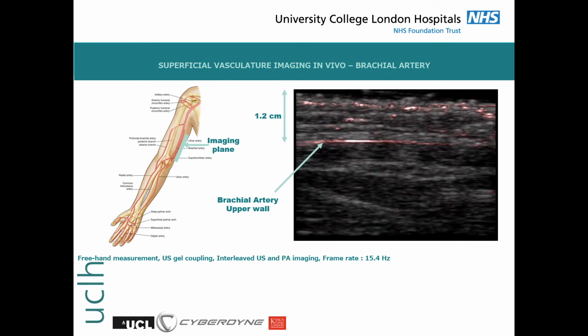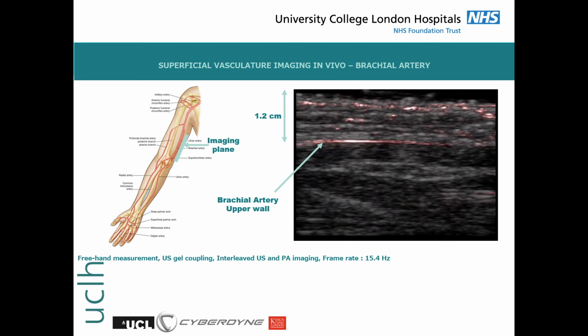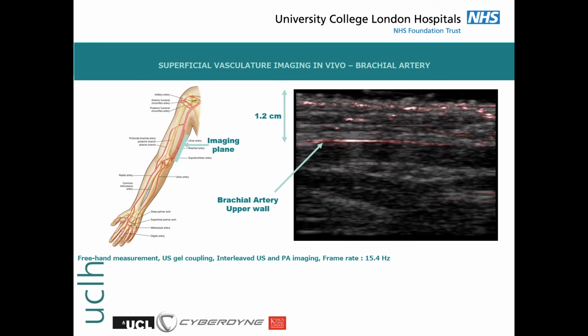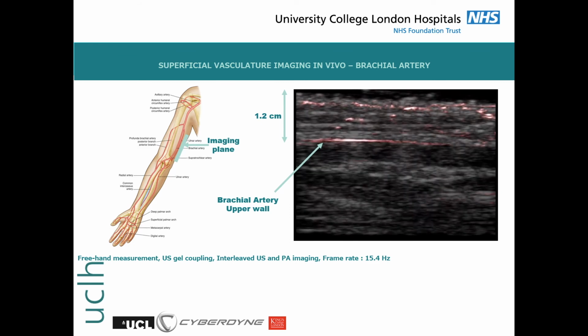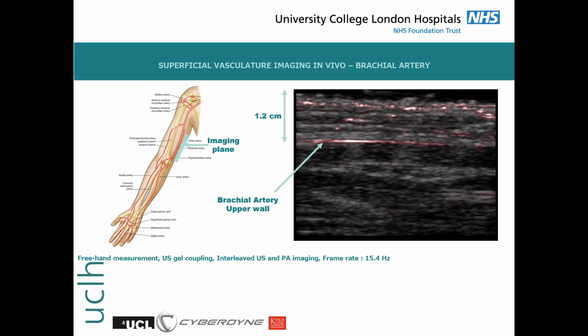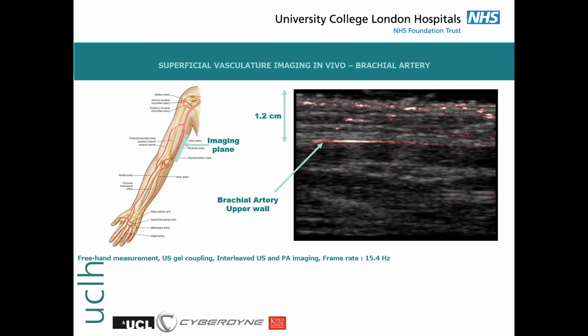This demonstrates that deeper and more clinically relevant targets can also be seen with the system, despite the expected reduced penetrance of externally delivered light. It was interesting, though, that the PAI predominantly enhanced the vessel walls in both experiments. A deeper vessel can be seen in this ultrasound image, but it is not contrasted by the PAI.